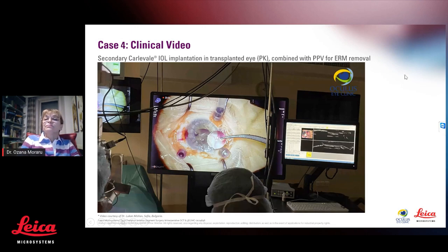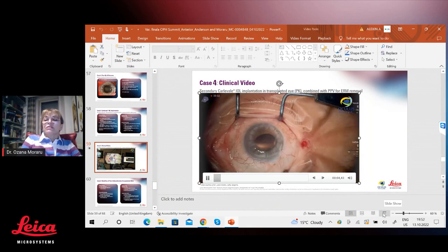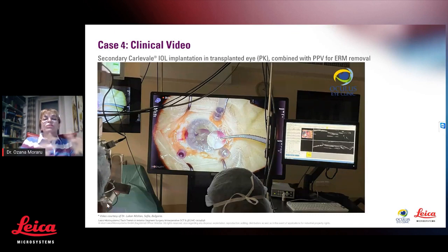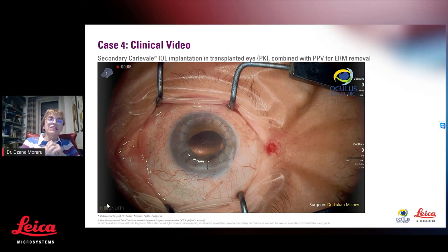Again we have a busy slide, so allow me to enter in this way. Maybe it will function better. Indeed. Let me see if the things are going. Yes, sorry for that, but this is a heavy slide.